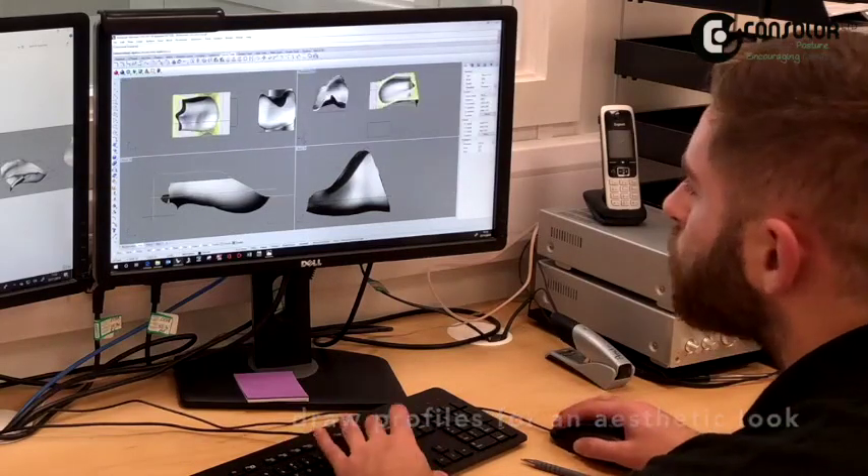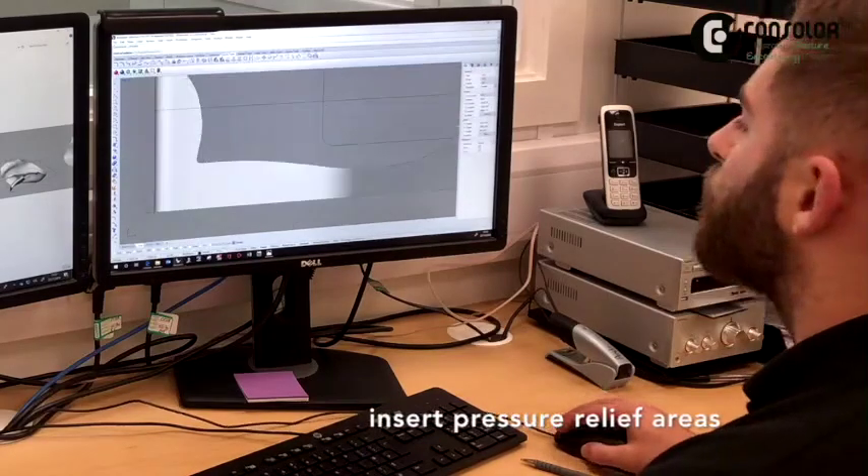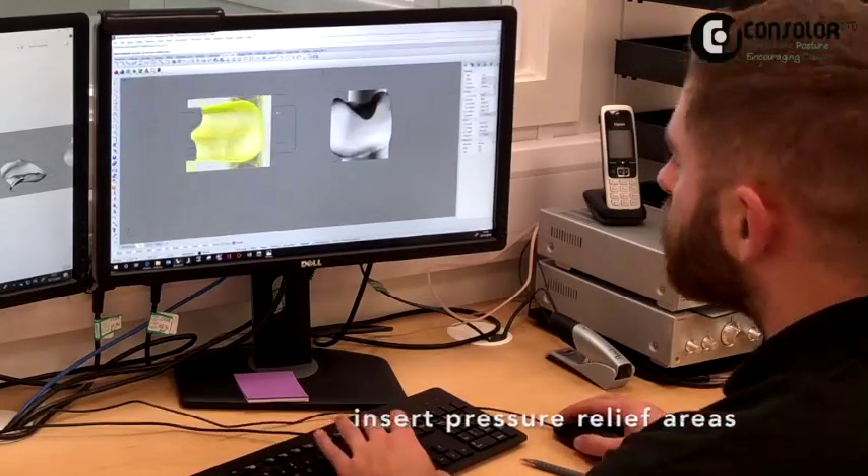Size and thickness of thoracic laterals are finalised to make sure arm function within the seat is maximised rather than being restricted.